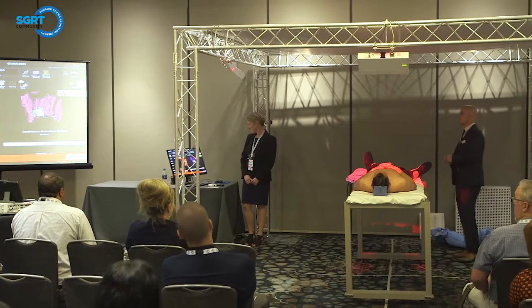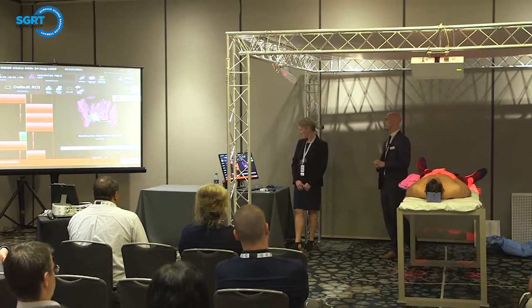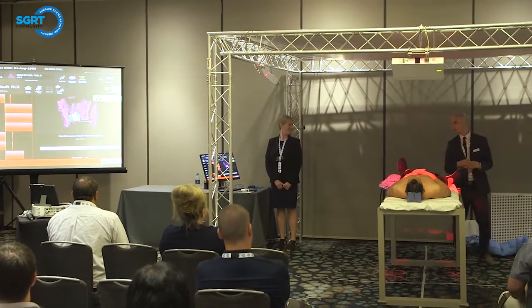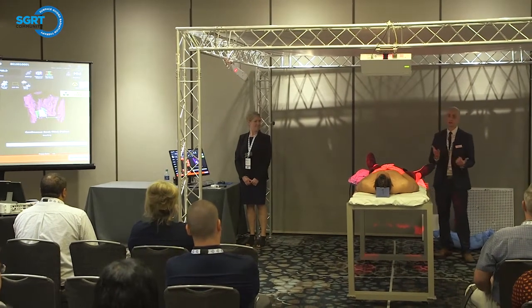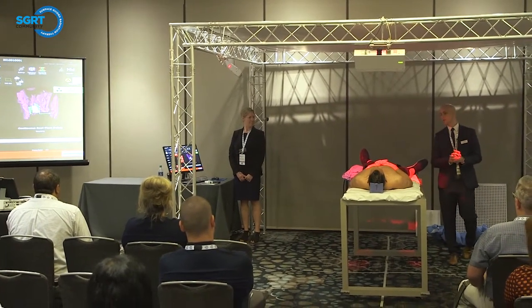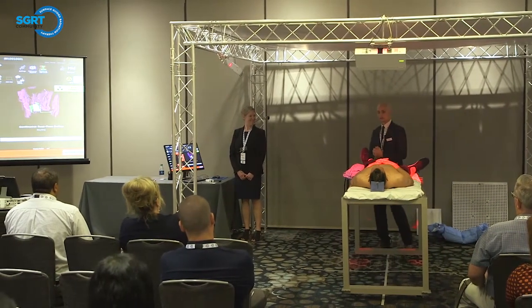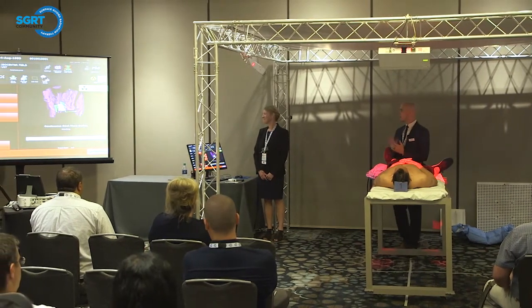First thing I want to do is set up my rotation, roll, and pitch first. I have a very large pitch value. There are a few things we can do to see how to fix this, okay? We can take a treatment capture like we learned earlier, take a look at the little arrows and see exactly where we need to go. We can show you that after if you want, or I can just troubleshoot and guess and check, right, as we go along. So he obviously has a pitch.